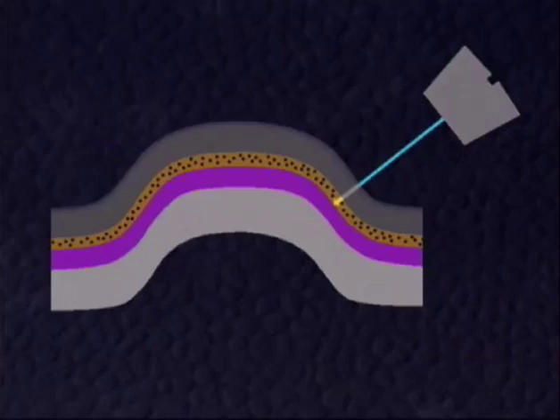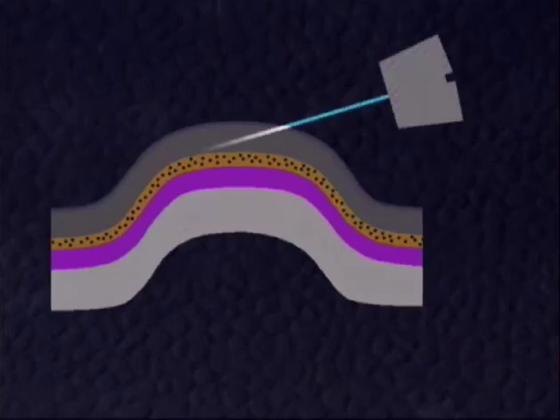below. Conversely, if the protuberance is examined at its summit, the tissue is observed almost parallel to its surface and appears the least transparent. The retina appears nearly white, opaque, and it hampers the view of the underlying pigment epithelium. This is shown in this example of scleral depression in a normal eye. At the summit of the protuberance, the retina appears white, and when the indenter is shifted backwards at the summit, a grayish zone appears as a mixture of white and black, caused by the obliquely seen whitish retina overcasting an obliquely seen blackish pigment epithelium.